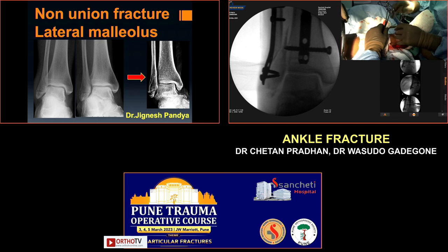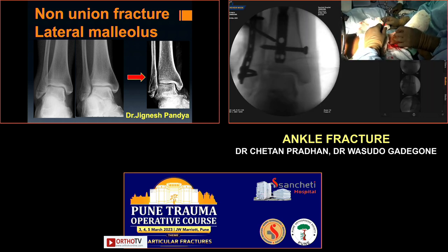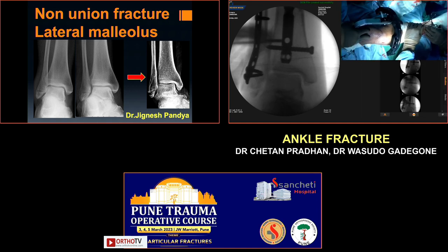Okay, we'll have the first case. Just 1 minute, sir. Jignesh, sir, just one minute. Please take us to the case. There is a tip of fibula fracture.